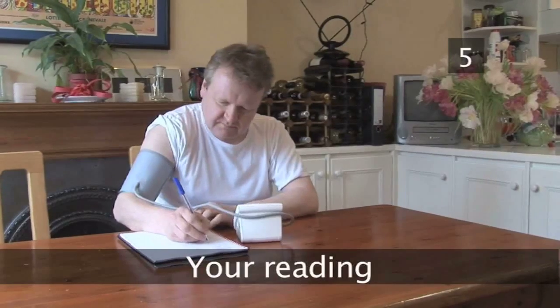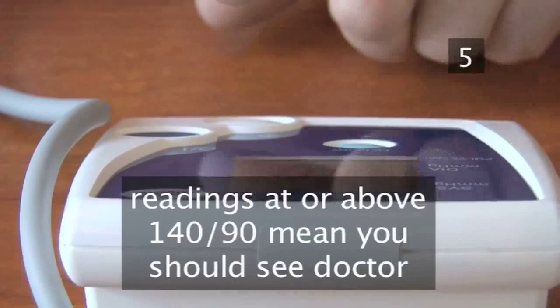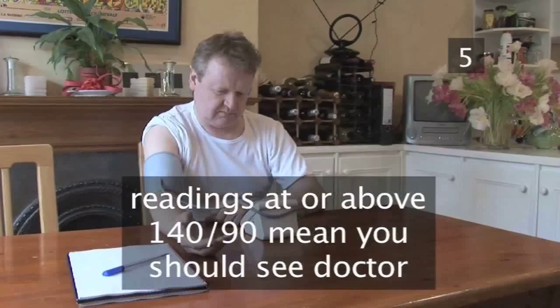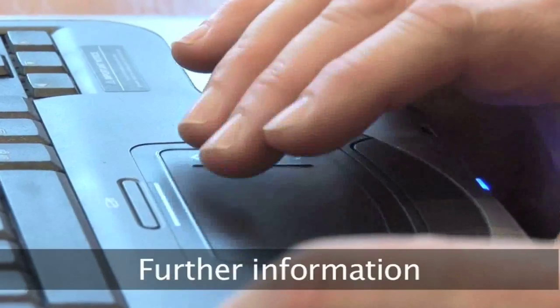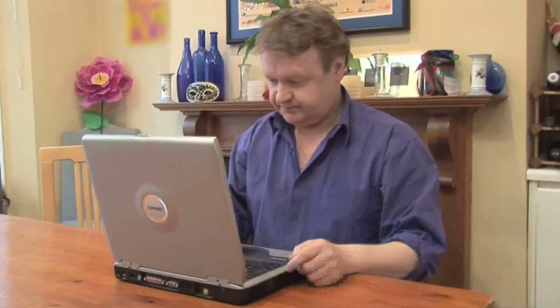Step 5: Your reading. If you are monitoring your blood pressure at home and have readings consistently at or above 140 over 90, and have not seen your doctor or nurse, you should do so. You'll find more information about blood pressure on the Videojug website and further links at the end of this film. If you do have concerns about your health, always seek professional help.